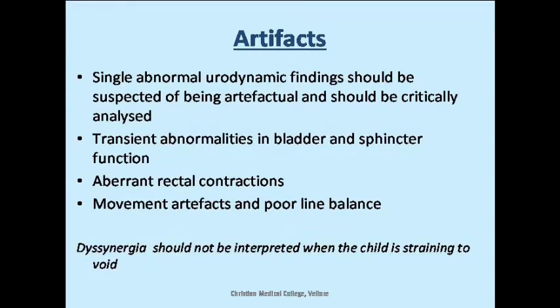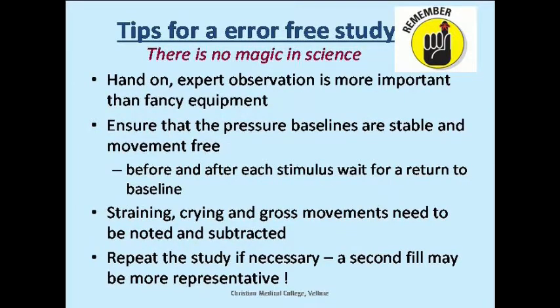What is the most important thing which a urodynamist learns? When do you say that you are an experienced urodynamist and you can probably report? I asked this question of one of the persons when I worked in the UK at Freeman Hospital, and he told me, Nitin, the day you learn to identify artifacts in your study and interpret them, that is the day you can say that you learned to understand urodynamics. I asked him how long it takes to do that. So he said, my conservative estimate is that at least you need to do 500 CMGs to be able to pick up artifacts clearly. So that's an answer.